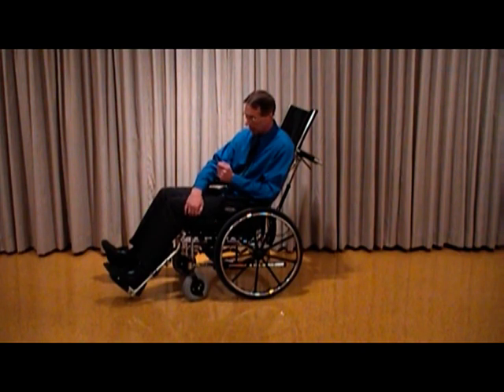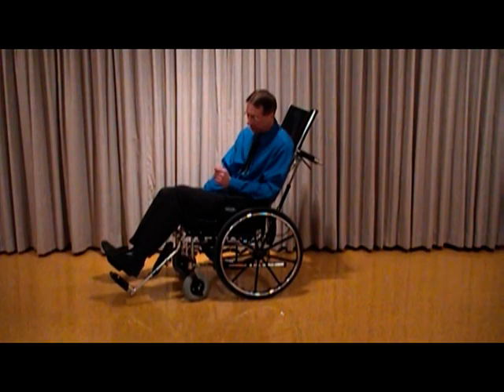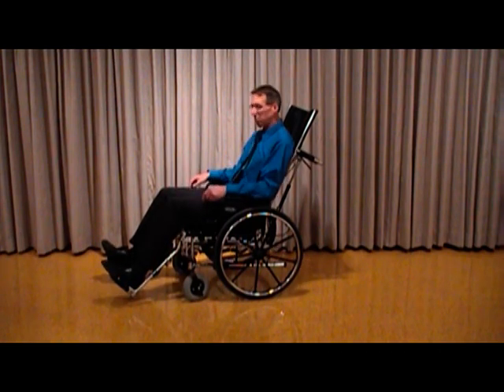You don't want it so low that you're getting cut-off pressure underneath the knee, and you don't want it so high that you can actually put your fingers under there and there's room between you and the cushion. This is perfect.